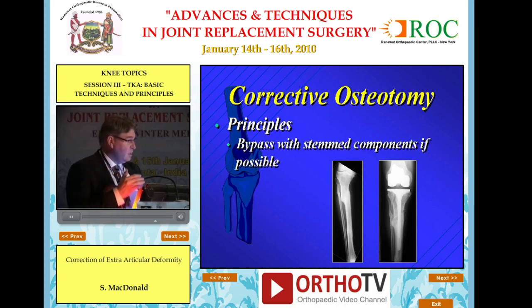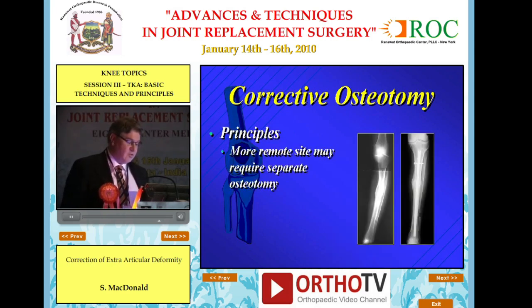We draw this out. In this case, felt that it was going to be compromising the stability of the knee to try and do it all through the knee, and performed a corrective osteotomy at the time and stemmed it. And I think, again, this is an 8-year follow-up, and this patient has done well. So those are sort of the easier ones. The more challenging ones are when they're more significant remote site.